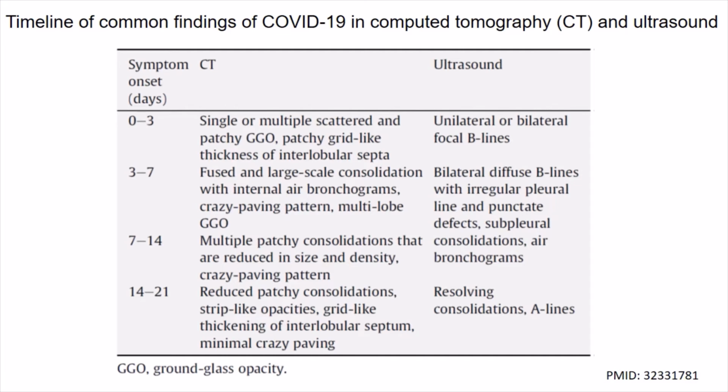Conclusively, we believe that ultrasonography may be helpful in COVID-19 management. However, its use in COVID-19 diagnosis and screening is limited, and so, chest CT scan remains the imaging modality of choice for diagnosing COVID-19. However, in places where chest CT scan is not feasible, lung ultrasound could be used as an alternative in the setting of the current pandemic.